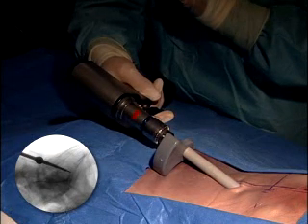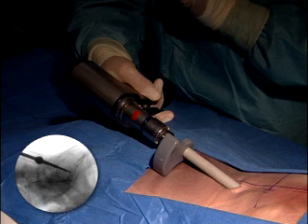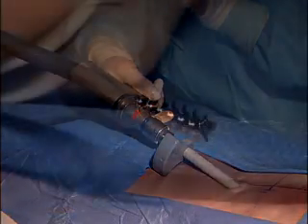The fluoroscopy image is saved and flipped to the second fluoroscopy screen. The tip of the drill is 30 mm from the sphere. This image can be used as a reference for gauging the depth of the tap and placement of the bone lock implant.